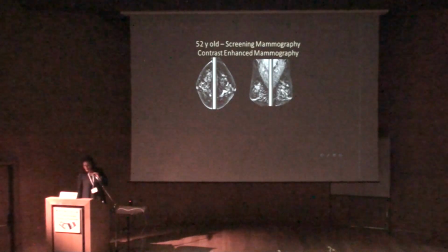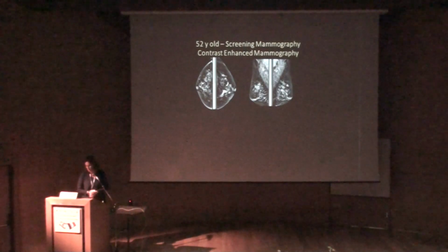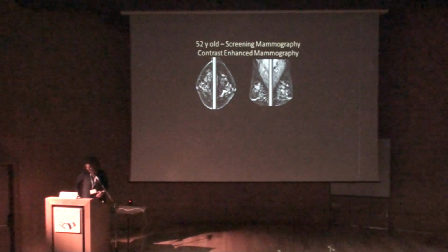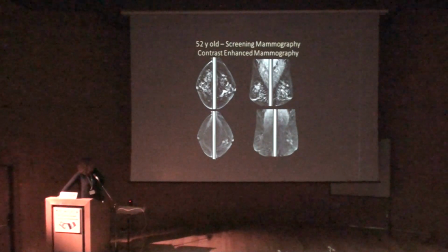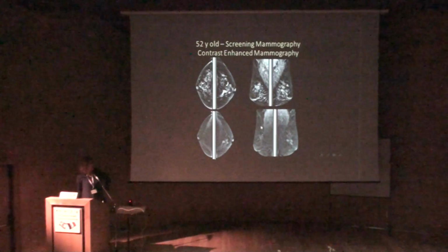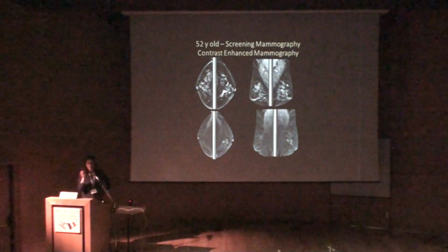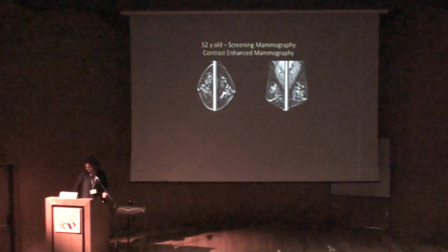Okay. And as you see, we have contrast-enhanced spectral mammography or dual energy mammography, and this is the study that she had. So this is her mammography, which we call a low energy mammography, and we immediately see the high energy, the contrast-enhanced mammography. And here we can see very clearly that she doesn't have anything on the right side, but on the left we can see those 3 lesions posterior to the nipple. Okay? So now it is around BI-RADS 4. We need to do a biopsy.